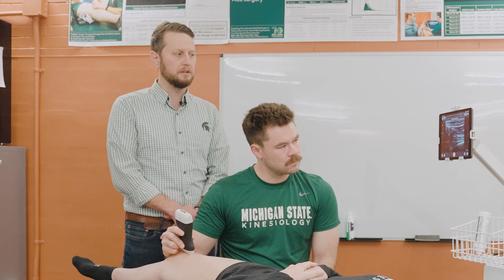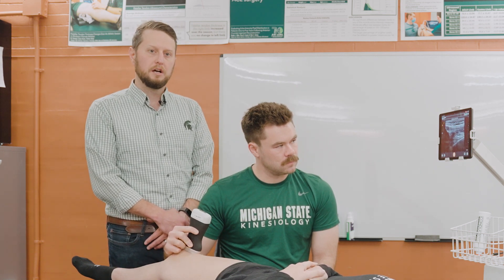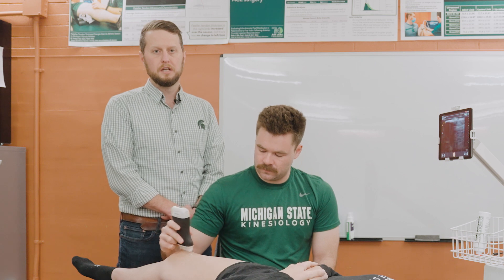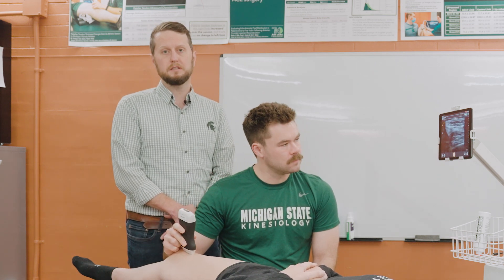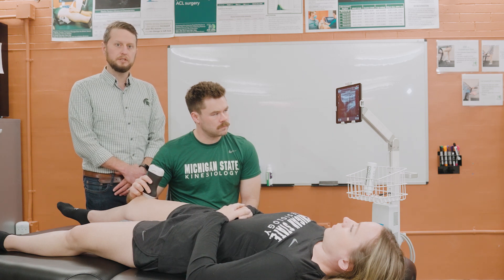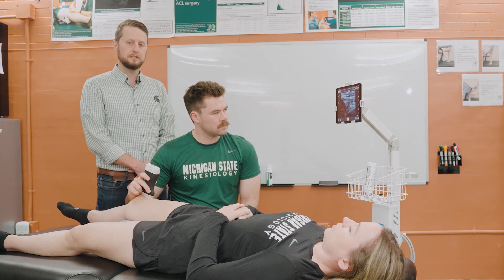Today, we're going to be talking about a suprapatellar knee scan that can be used to detect effusion synovitis in the knee after patients following knee injury and knee surgery. The reason we're using this type of scan is because inflammation seems to be an important reason why patients are developing arthritis in their knee following knee surgery, so we can use this as a way of monitoring those inflammatory changes within the joint.